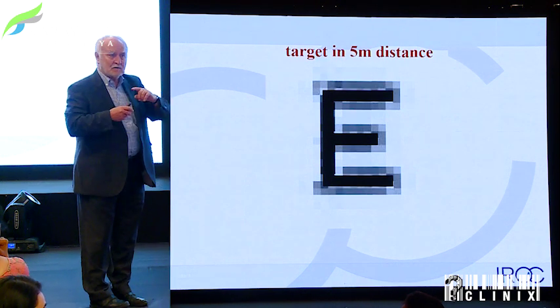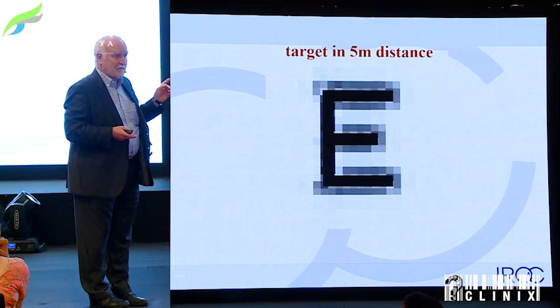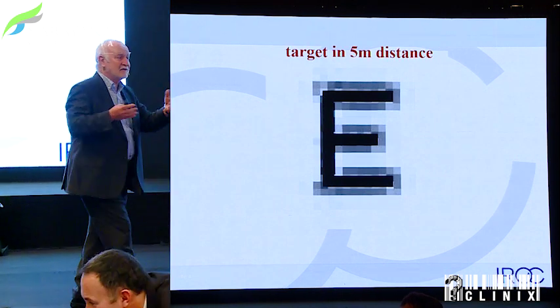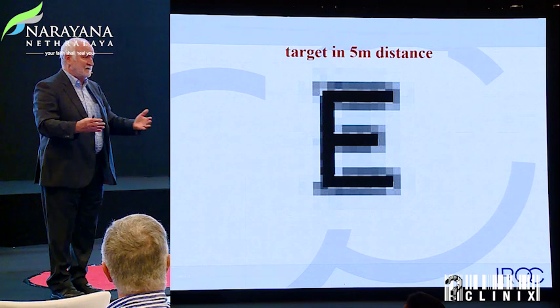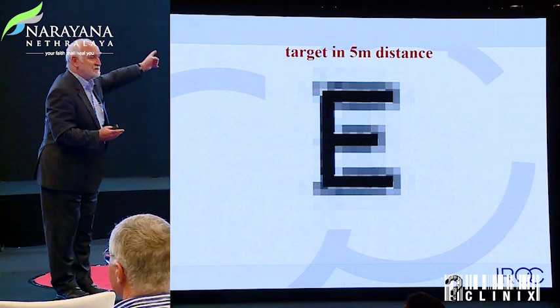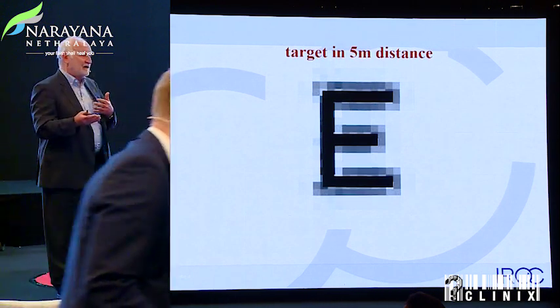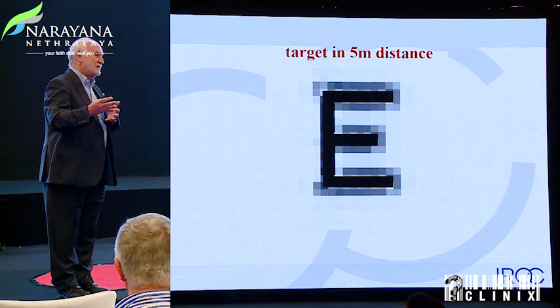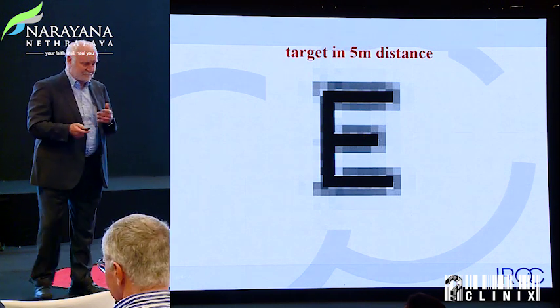So in patients who have an astigmatism where none of those is sharp, that will not work. Or if you have a multifocal cornea, like after hyperopia correction, for example, with a huge Q factor, that will not work because none of those images is sharp. Then the multifocal lens will not give you the full spectrum of benefit, but the full spectrum of side effects. And that is not beneficial for the patient either.